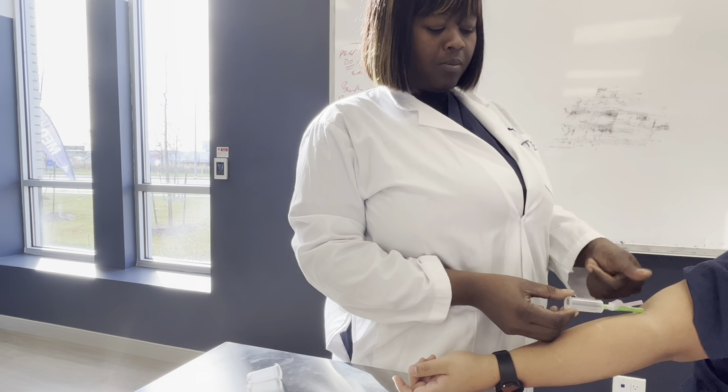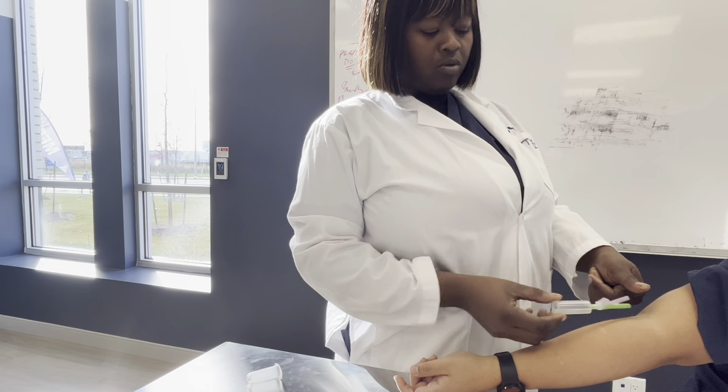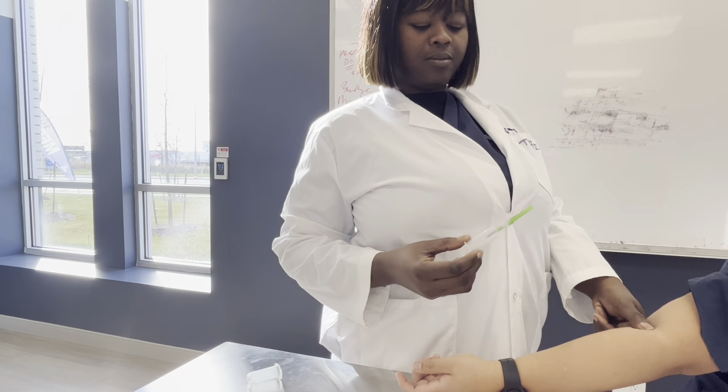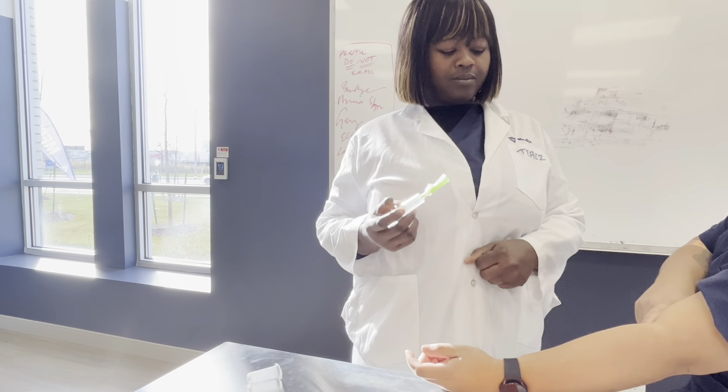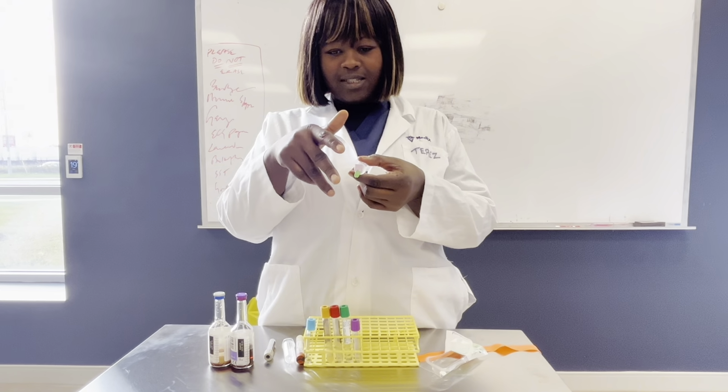get your cotton swab, place it on. Don't press it on, just rest it there. Remove the needle, apply pressure. Bang, that's how a routine blood collection works. Thank you so much.